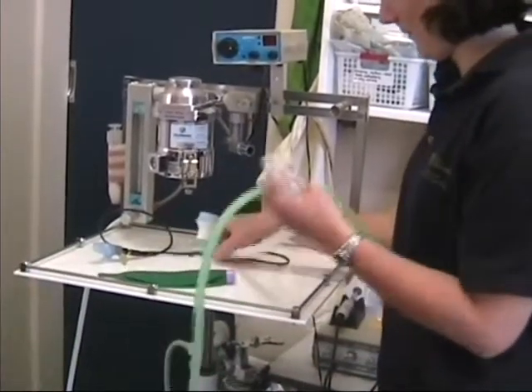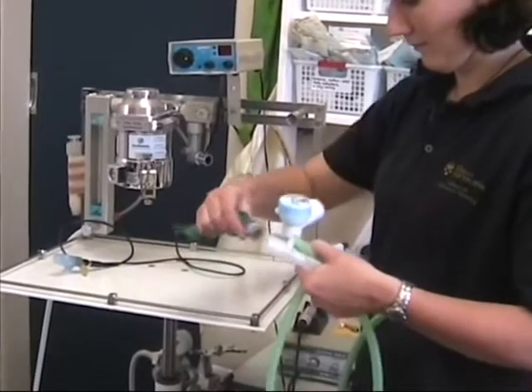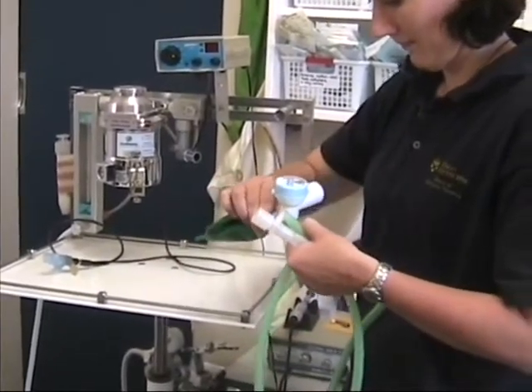An Ayres T-piece is an example of a non-rebreathing patient circuit. There is generally an attachment for the re-breathing bag close to the pop-off valve.